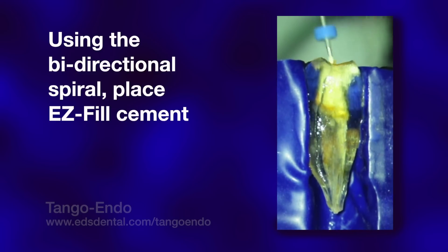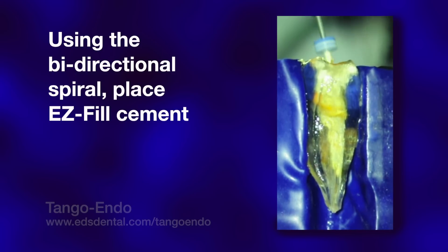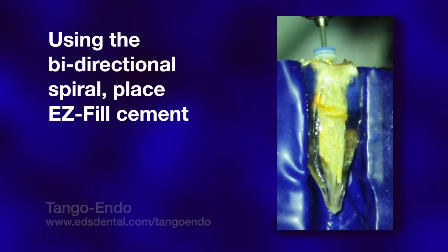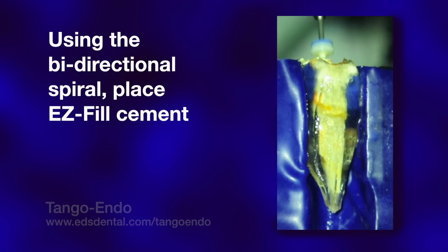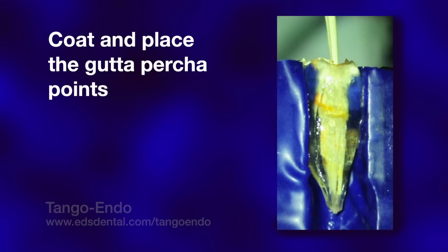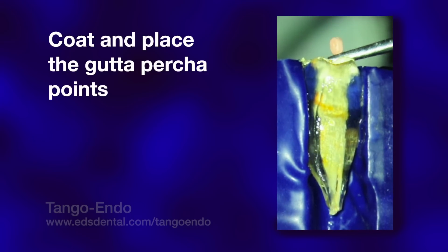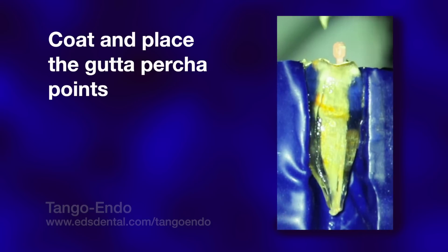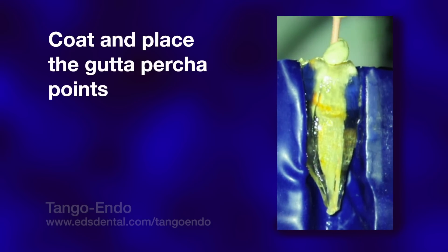We use the bi-directional spiral as a cement applicator. It is used approximately 4 millimeters short of the apex, as well as more coronally, where a common space between the canals exists. The spiral is loaded with cement and, using an up-and-down motion, applied to the walls of the canal in the common coronal area as well as the two independent canal pathways. After flooding the canal space with cement, each of the two pre-fitted points is liberally coated with cement and reintroduced into the canal, fully filling the canal space with a combination of cement and gutta-percha.